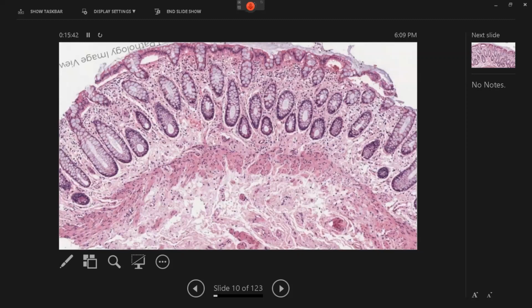And then we visited the inflammatory process. And in the last lecture we talked a little about edema and how it can mask the inflammatory cells, at the end of the lecture. And we said, for example, in Clostridioides difficile infection, what tends to happen is that you get edema and that masks the inflammatory cells. But at the same time there are other conditions where you can see that the number of inflammatory cells is less, right?